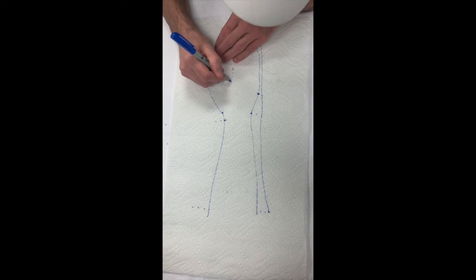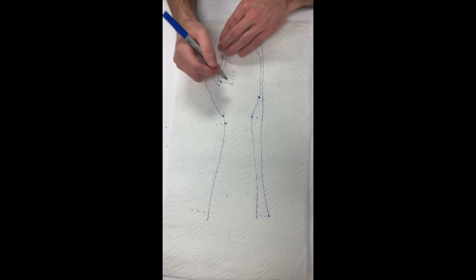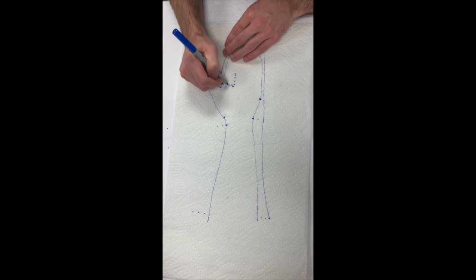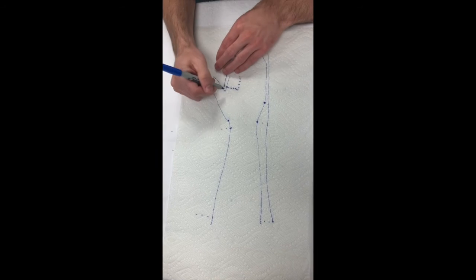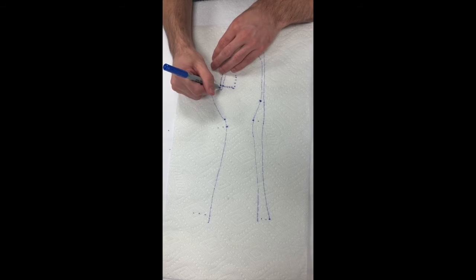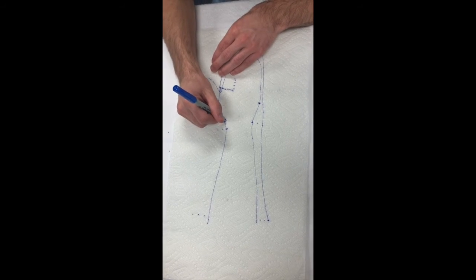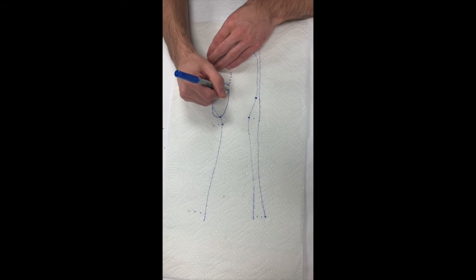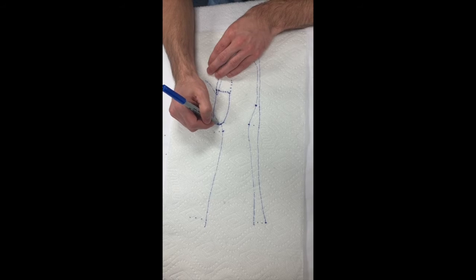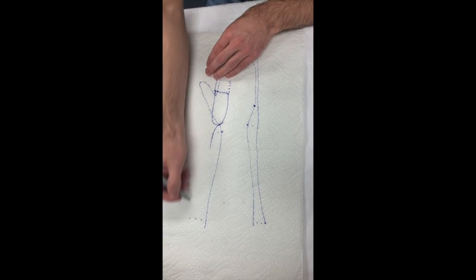From the second and third web space, connect the line down from the thumb web space. Make sure to mark X's on this because you do not want to cut this area when cutting the pattern. Connect the dots, making a semicircle.